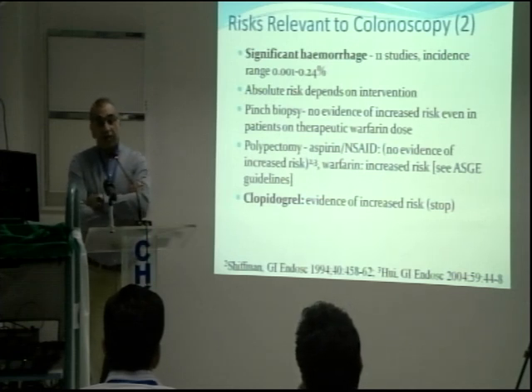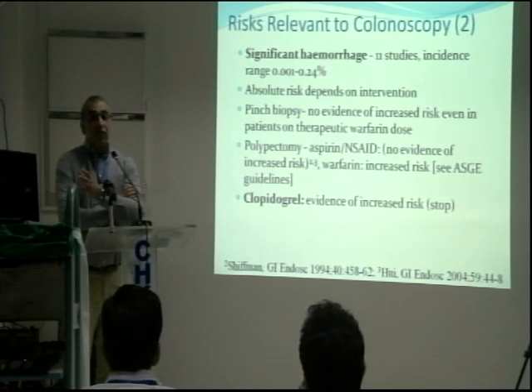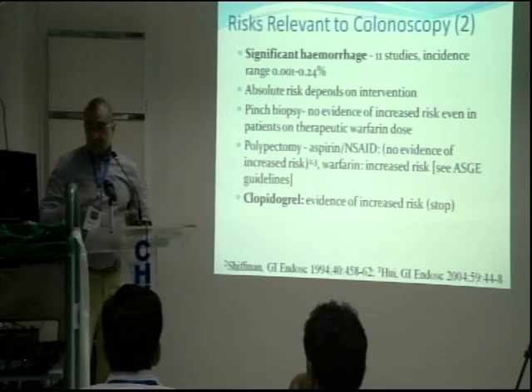With certain procedures, especially taking pinch biopsies or forceps biopsies, the risk is negligible. Even if the patient is on full dose anticoagulation, it doesn't make any difference. You can still take biopsies.